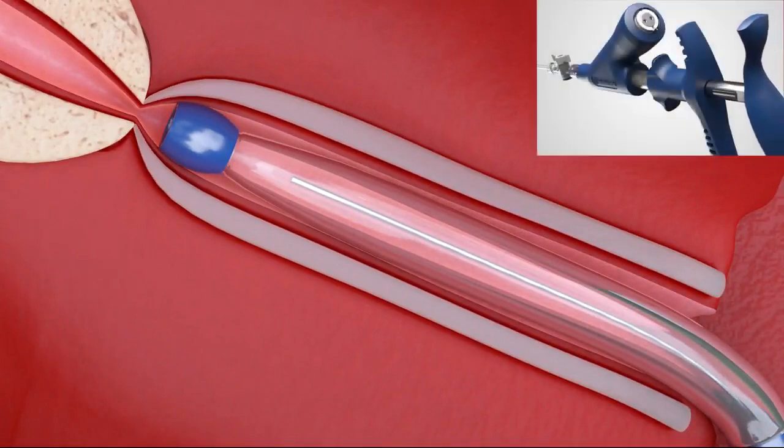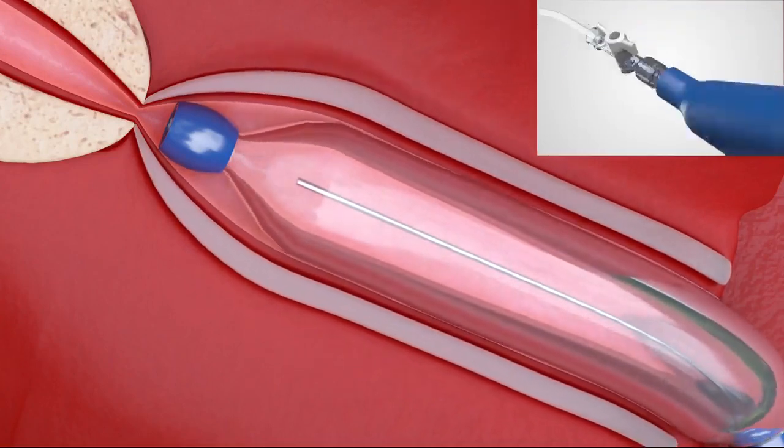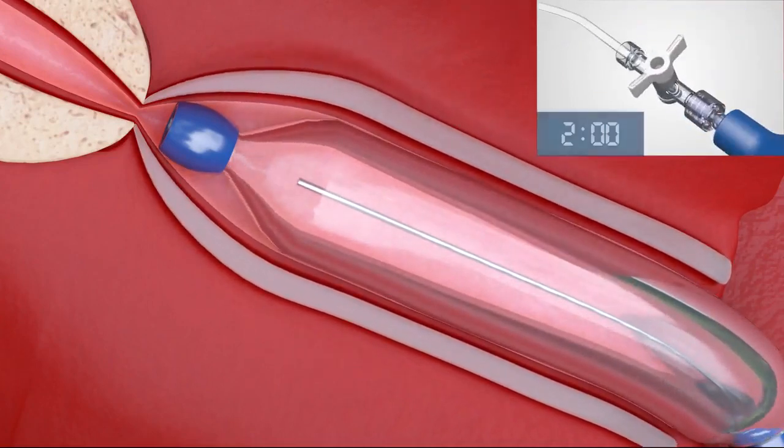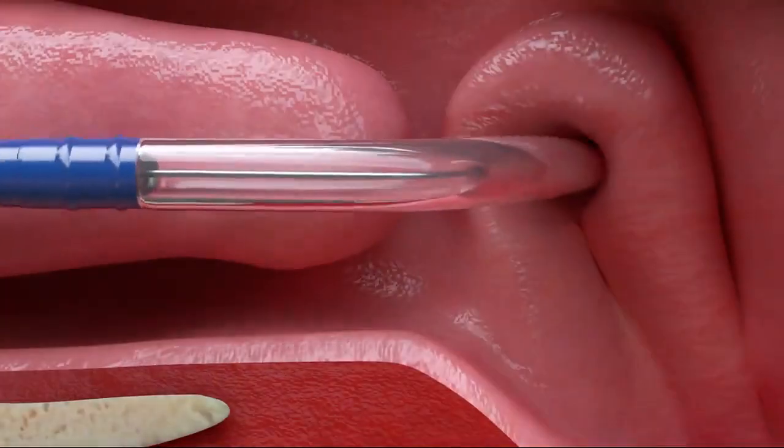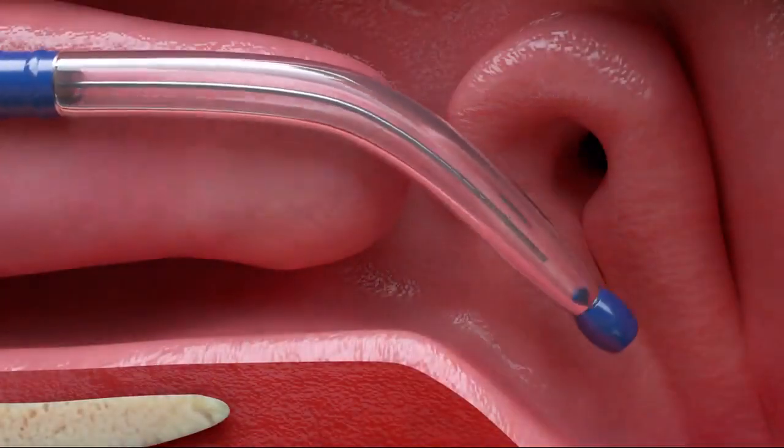Inflate the balloon and turn the stopcock valve 90 degrees, holding the inflation for two minutes. At the end of the two-minute dilation time, release pressure in the balloon and retract the inflator handle to deflate the balloon.